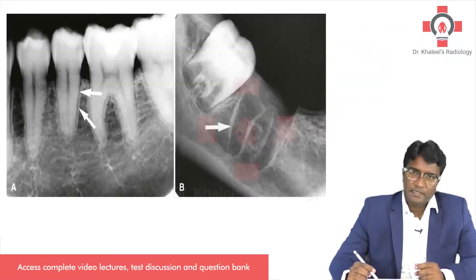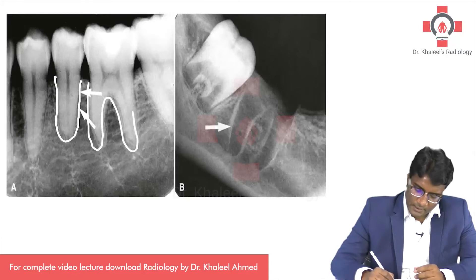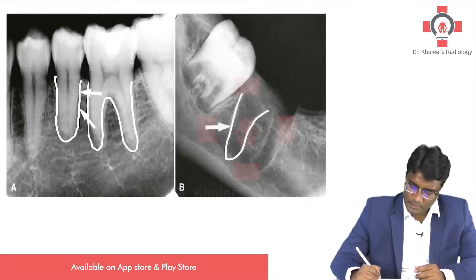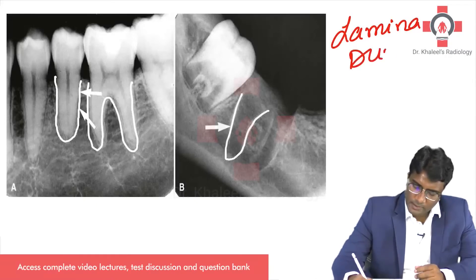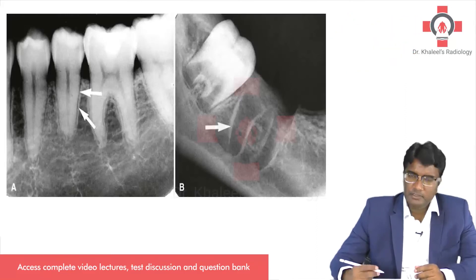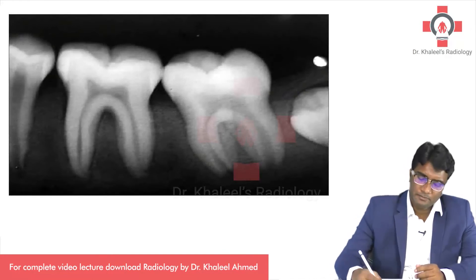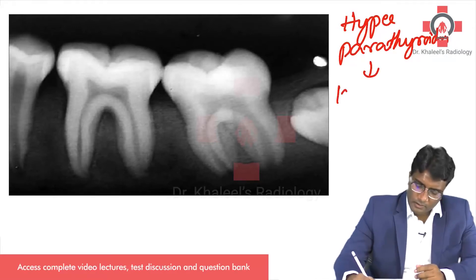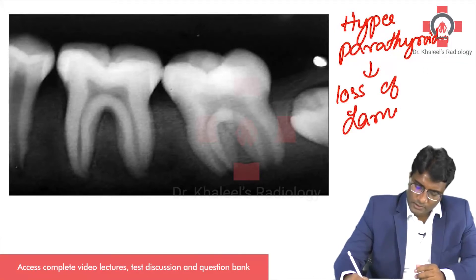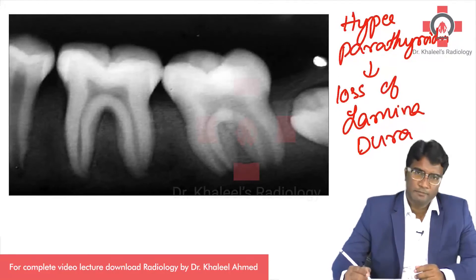Another important finding: there is a sclerotic margin seen adjacent to the teeth socket, called the lamina dura. Normally, lamina dura is present adjacent to the teeth socket as a sclerotic margin. But in hyperparathyroidism, there is loss of lamina dura — I do not see the sclerotic margin here. Loss of lamina dura is also a feature of hyperparathyroidism.